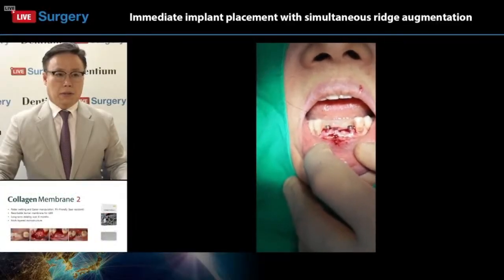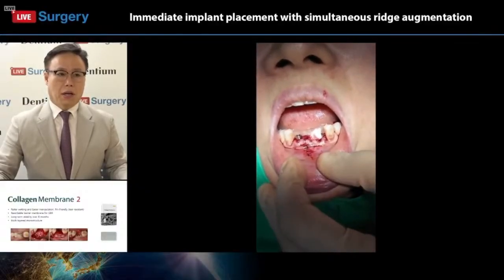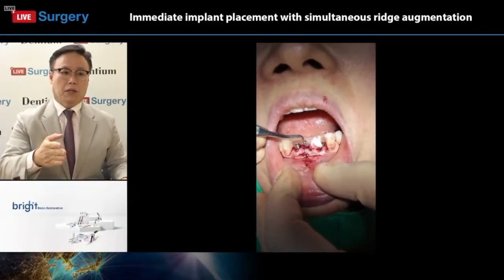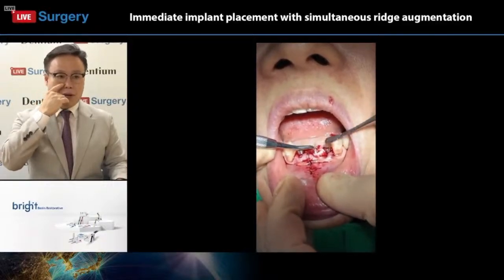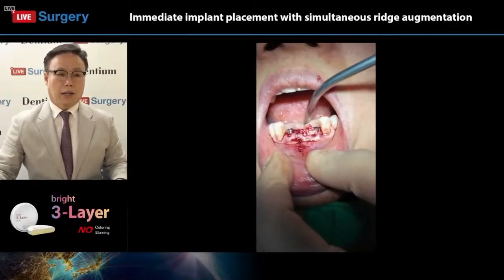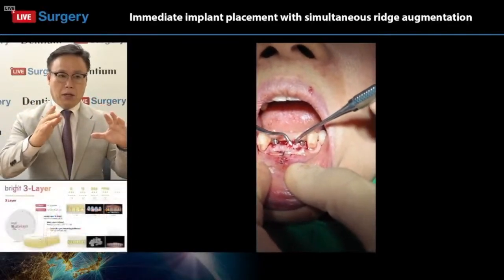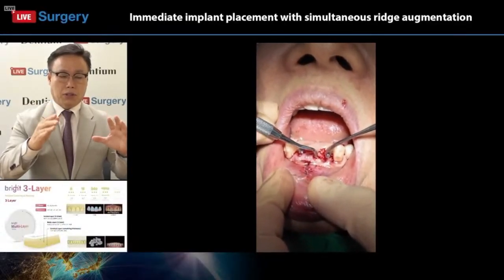Okay, that's it. So we apply the vestibular incision, as now it's the socket preservation, ridge preservation technique. Vestibular incision, and evaluate the inside, the presence of dehiscence defect or the bone loss around the implant. And once we finished, we expected the necessity for applying the horizontal augmentation.